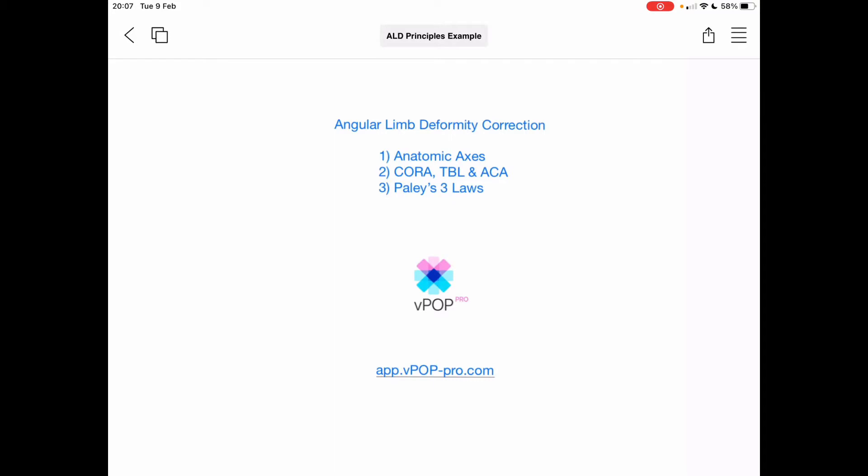Whether you're planning for a TPLO, a CBLO, closing wedge or TTA, you can plan your cruciate cases in an instant with fingertip precision. Whether it's a trauma case or a total hip or knee replacement, VPOP has all your favourite implant templates, all with crystal clear footprints — you'll never see a pixel or want to plan with anything else.